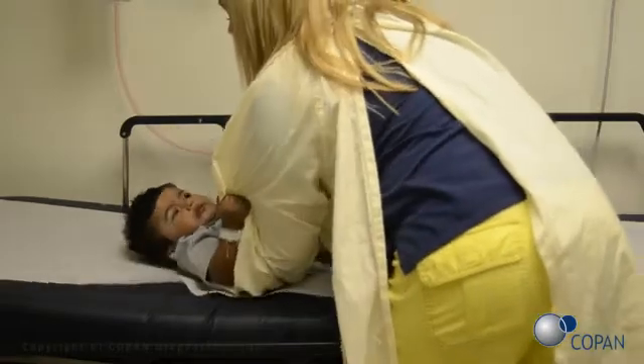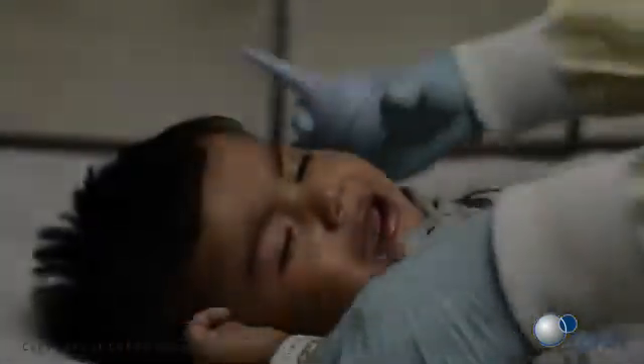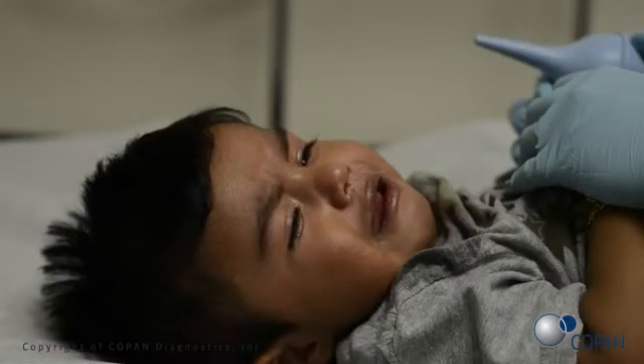Lie the child down or have the parent or guardian hold the child so that their head is tilted back and neck is extended to allow for the pooling of the aspirate in the nasopharynx.